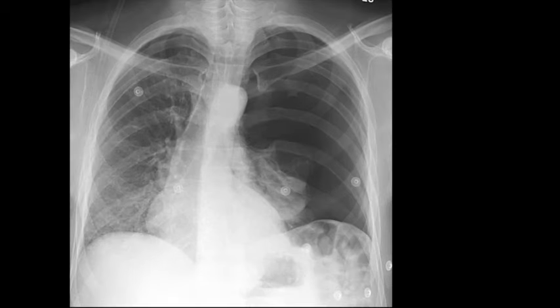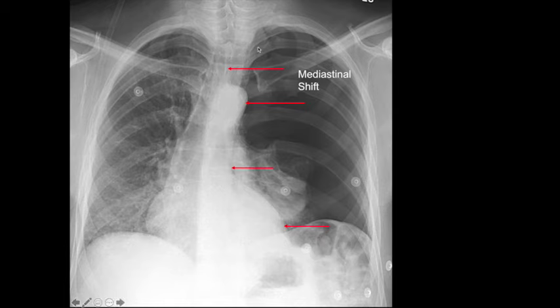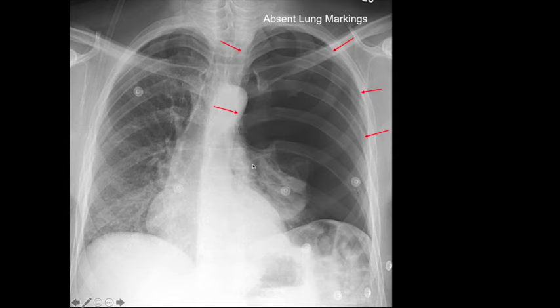In going through our approach, there are no lines and tubes here. The heart and mediastinum are clearly shifted towards the right. When we look at the lungs and compare both sides, you'll notice that the left side is extremely lucent. You'll also notice that there are absent lung markings in the majority of the left hemithorax and a collapsed left lung.